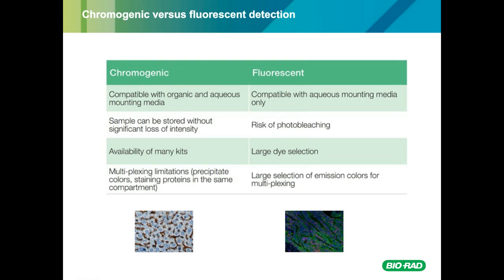When performing a double staining for two proteins that localize in the same subcellular compartment, be aware that once the first chromogenic precipitate, a result of the chromogen and substrate reaction, has stained or saturated the compartment, it becomes very difficult for the second one to stain the same compartment adequately. Designing experiments with multiple enzymatic labels also has its challenges due to the limitation of color detection combinations.